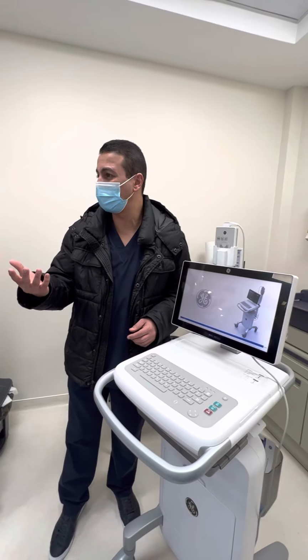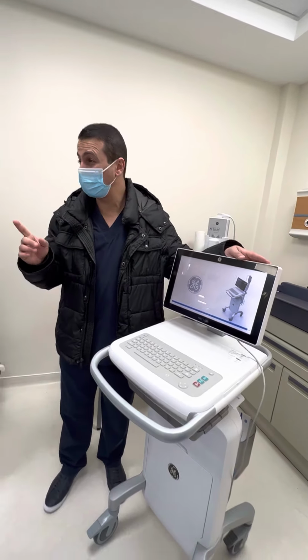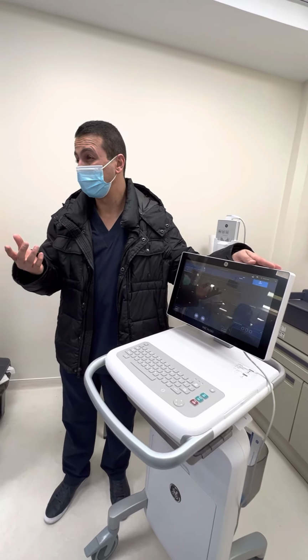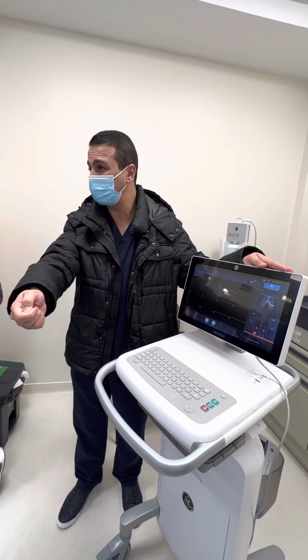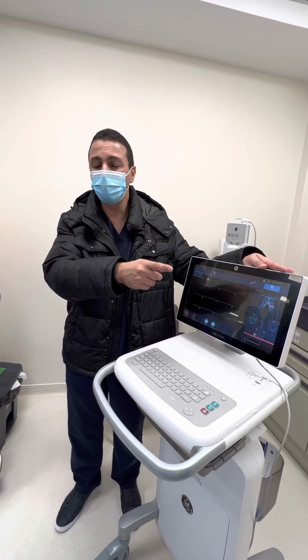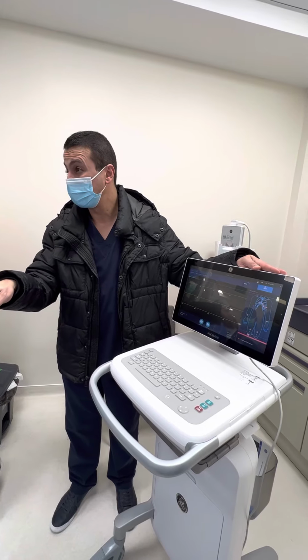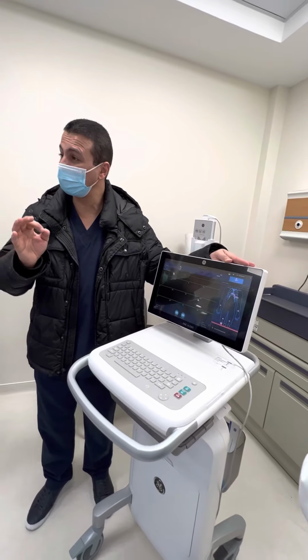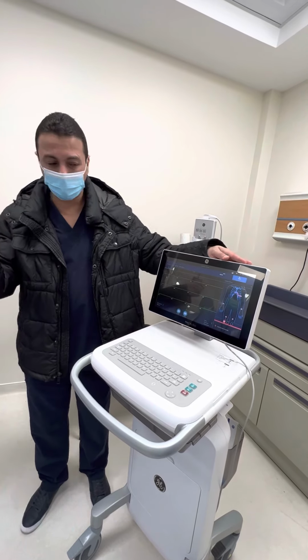A better signal or not. That's what we developed actually in here. So sometimes there is no time to enter your patient demographics, right? So what will you do? You will acquire an ECG, you will print out the report, catch the event, show it to your physician. But what about that report on the machine? It will be transmitted to the system, to the Muse users, and they will find nothing next to it, so they will delete it. So you have to make sure that you put your MRN of your patient, the two patient IDs. No need for a manual entry. I will show you the other way.